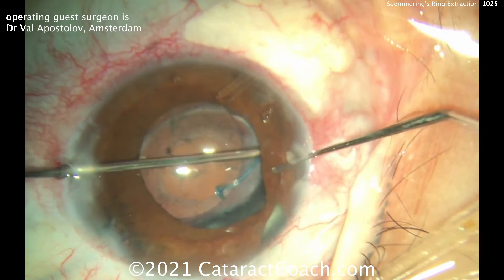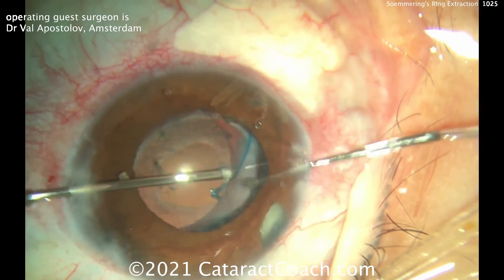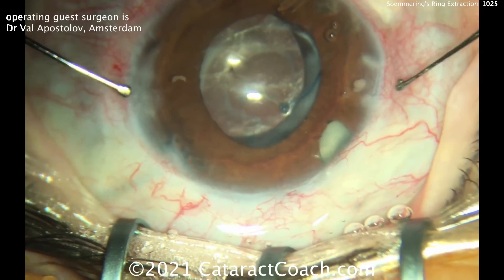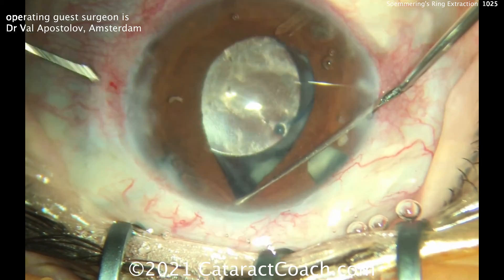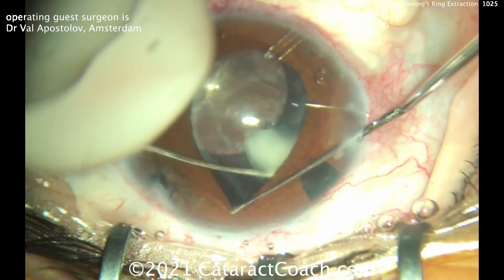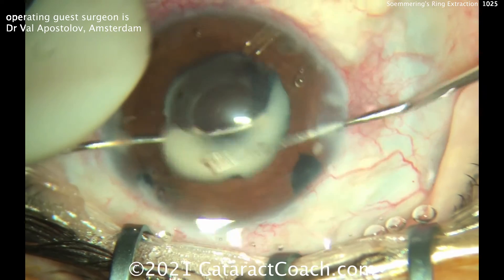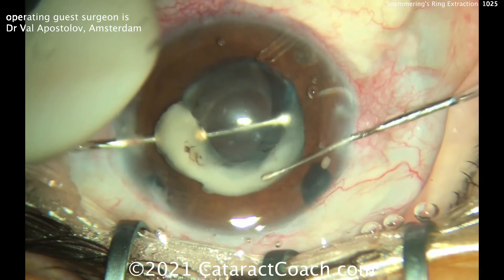Now you can see there's a posterior capsulotomy in the back, and the anterior rhexis is actually pretty good sized. He's taking his time to get this out. The question is: with a large peripheral iridotomy like that, by removing the Soemmering's Ring, is the patient going to notice additional glare from light entering that large PI? Who knows — but let's get this thing out. You don't want to leave that inside the eye. Look how big that is — that has to come out. Let's dial it up into the anterior chamber.